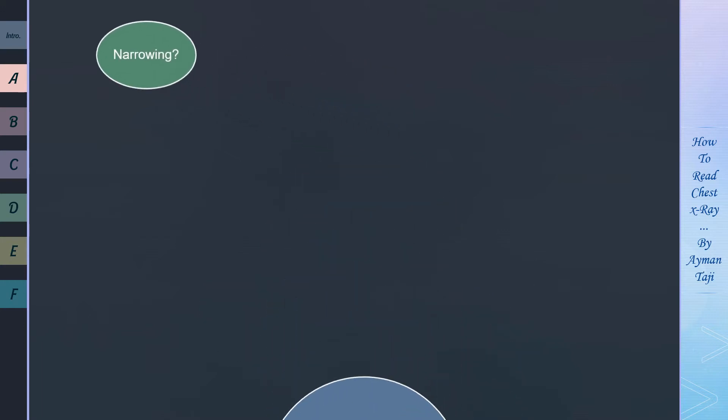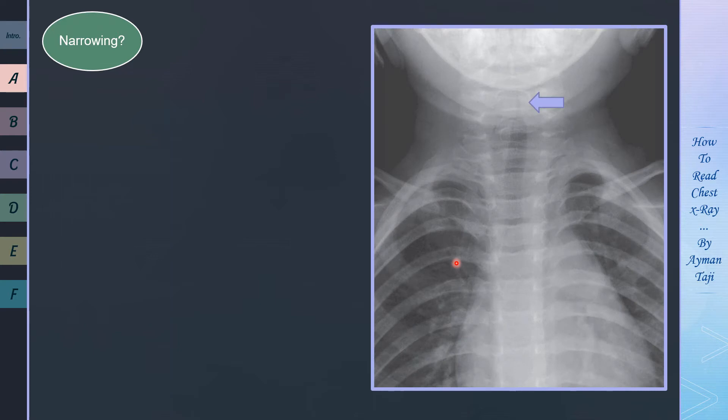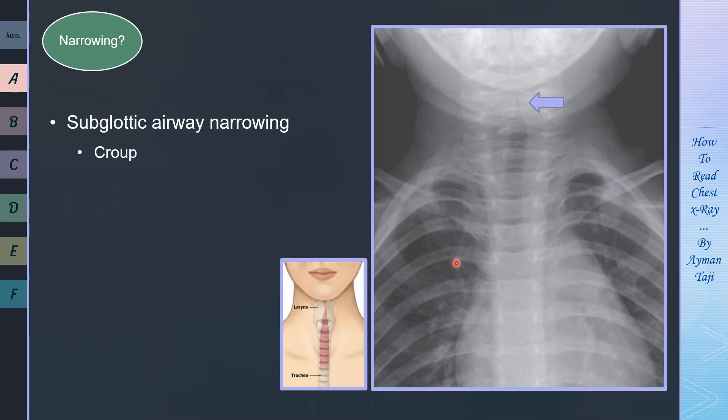Let's take each point in detail and we'll start with airway narrowing. The most important case is narrowing of the lower part of the larynx, known as subglottic airway narrowing. This radiographic finding can be seen in croup, which is one of the most common infectious pediatric emergencies, usually caused by a virus and leads to swelling inside the larynx and trachea which interferes with normal breathing and produces the classic symptoms of barking cough and respiratory stridor.